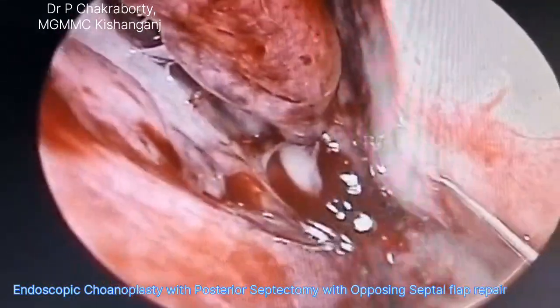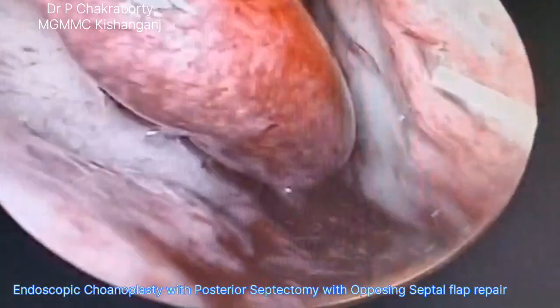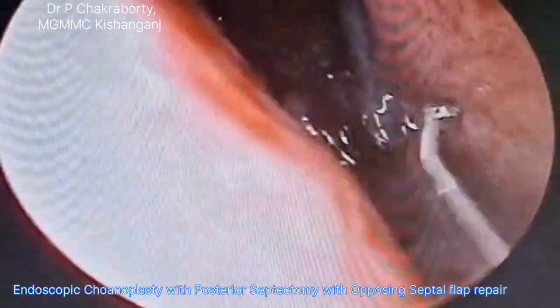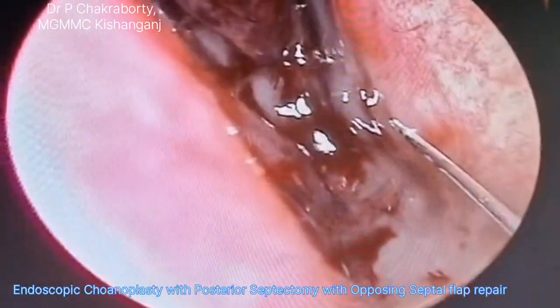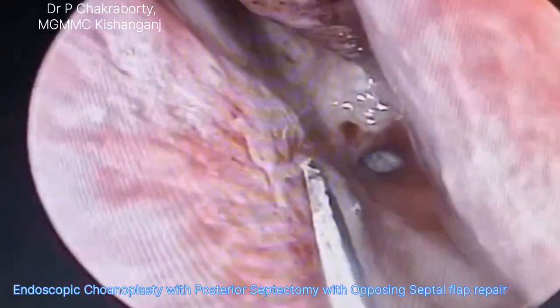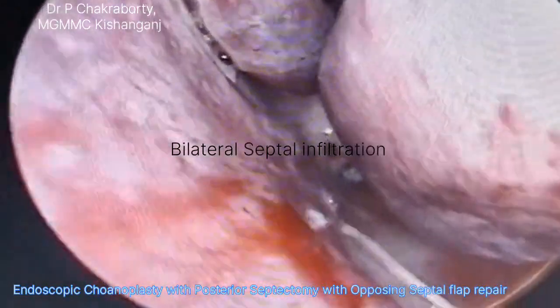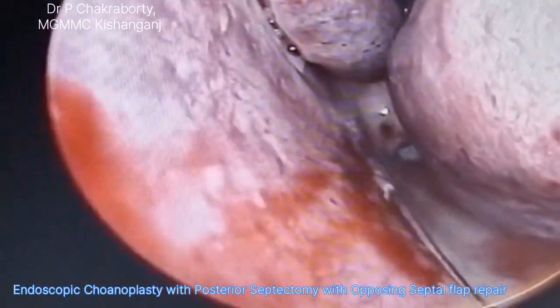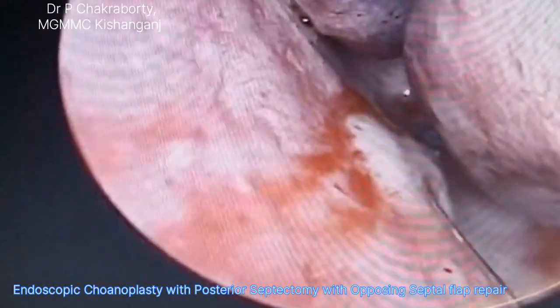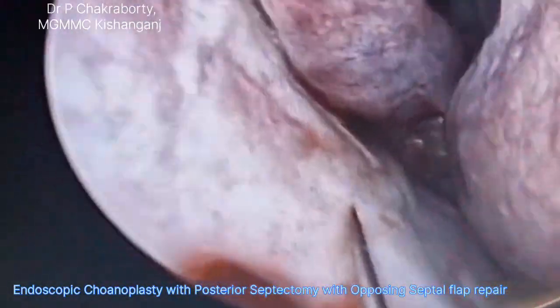So now we proceed on to infiltration of the septum, as we will be doing a posterior septectomy, and the process we are following for this endoscopic choanoplasty was first described by Aldo Stam. So in this technique we remove the posterior part of the septum so that there is no chance of synechia formation between the medial and the lateral wall, and we also create two flaps, one in the superior aspect and one in the inferior aspect.